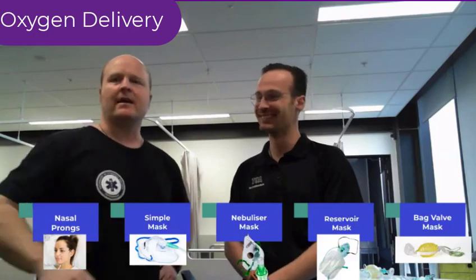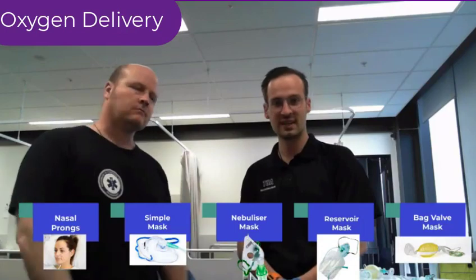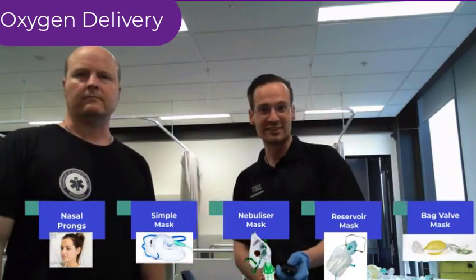I'm Brayden. Alright, and today we're going to go through oxygen delivery methods. So first up, we're going to get to nasal prongs.